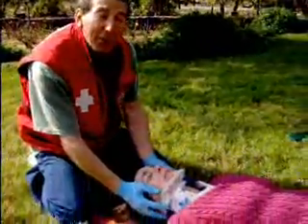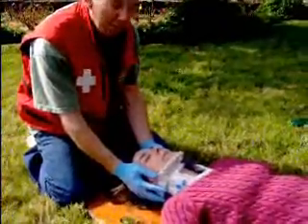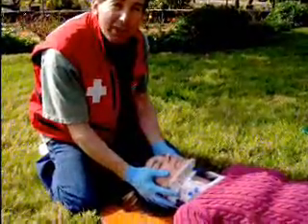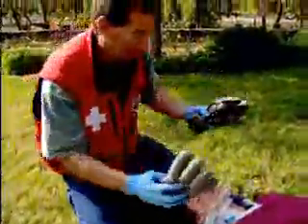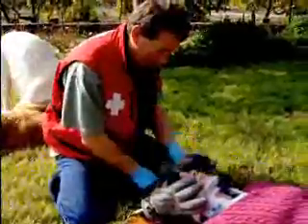Any time you're doing an immobilization of the spine, you need to have somebody who's keeping the head immobile — and they stay on the head until the person is successfully put down. We'll put these props here so that her head has been immobilized.